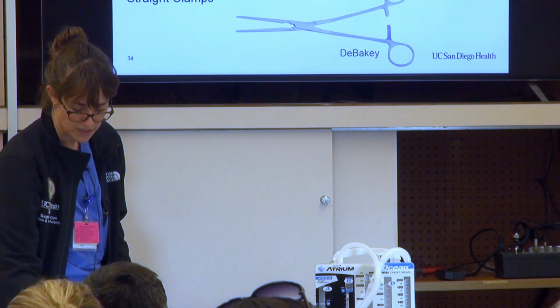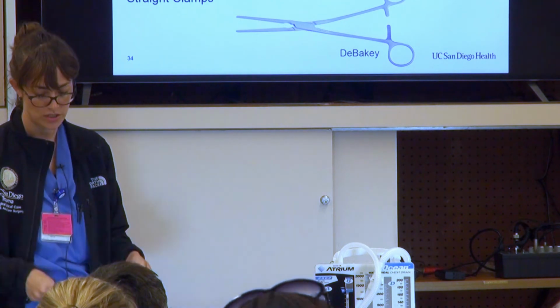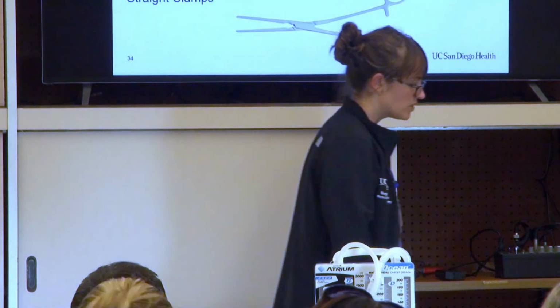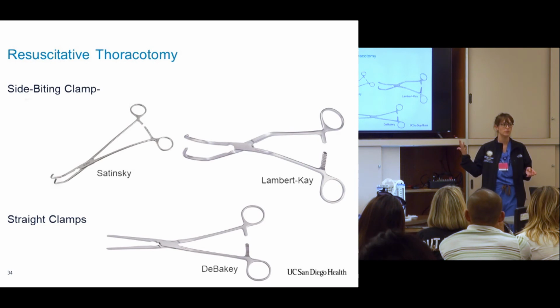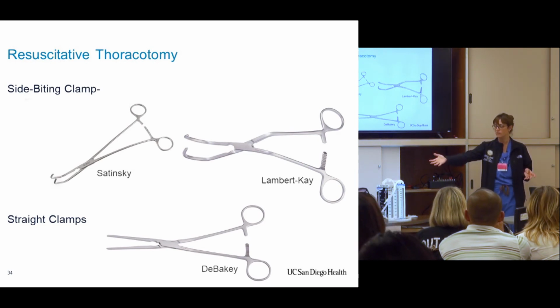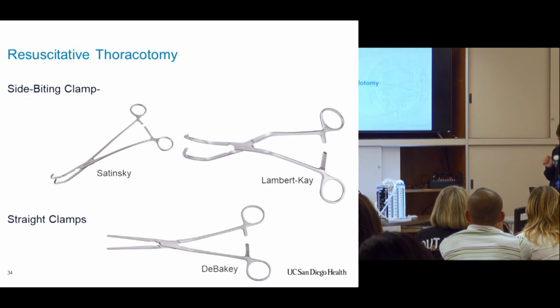And sometimes people, instead of just using a knife to get all the way through, are using some big scissors to get into the chest initially. It's actually very hard to be doing the left thoracotomy, trying to get into the chest, and then get the instruments you need. Most surgeons, or all surgeons, are used to somebody handing them an instrument. So in that setting it's really challenging, and you'll hear people yell, just bring the tray over here, because when they ask for something, nobody knows what to get them. So if you familiarize yourself with these instruments, it will be hugely helpful, and we can all try to save the life that is already lost.